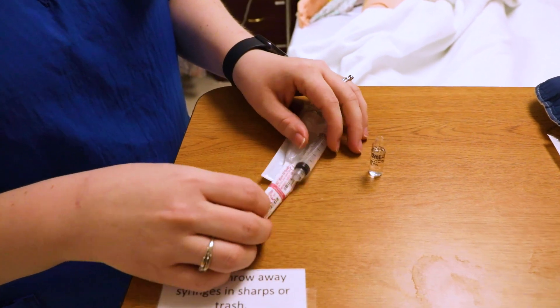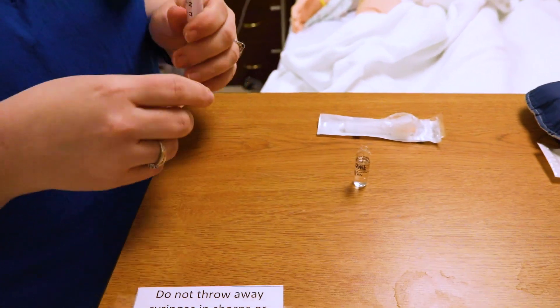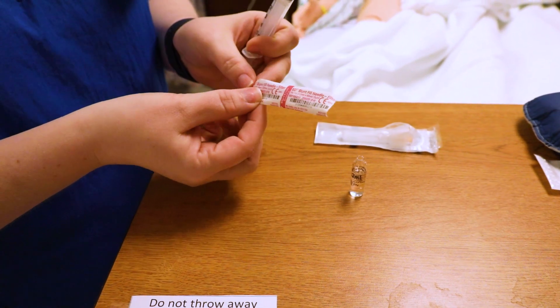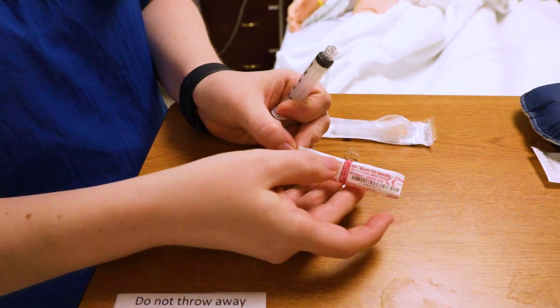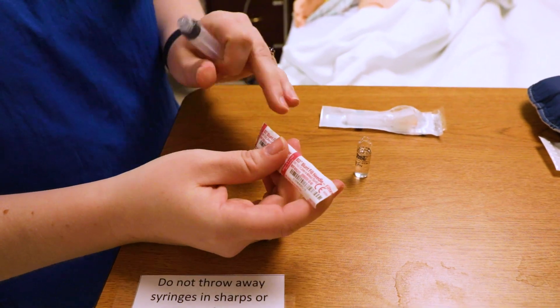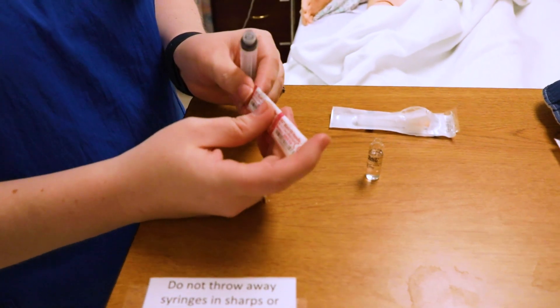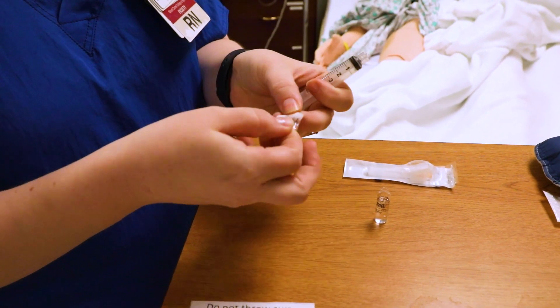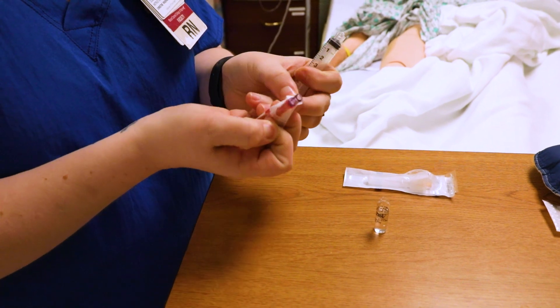Now we've got the ampoule here — make sure you see that it's face up. When you draw medication, you need to use a filter needle, because when you broke the glass there is a chance that glass got into the medication, and you want to make sure it doesn't get into your patient.